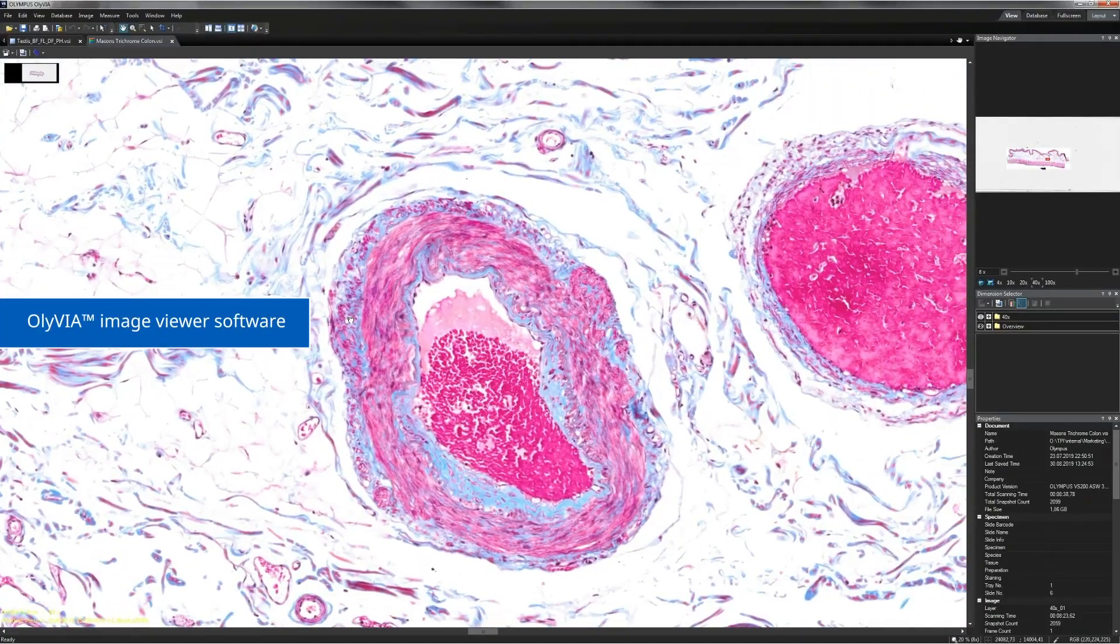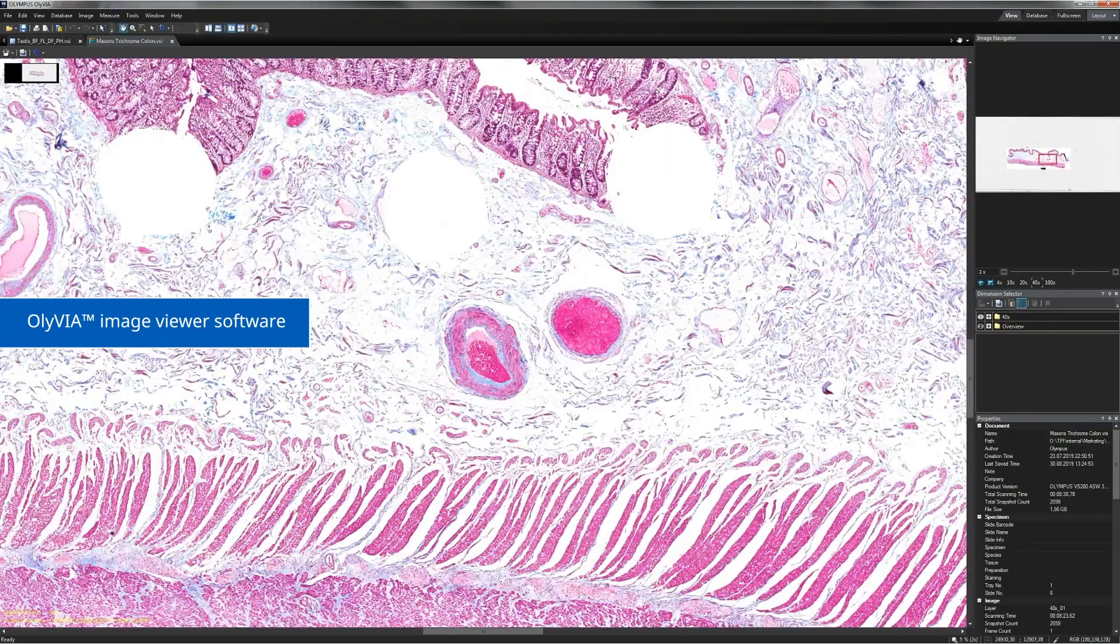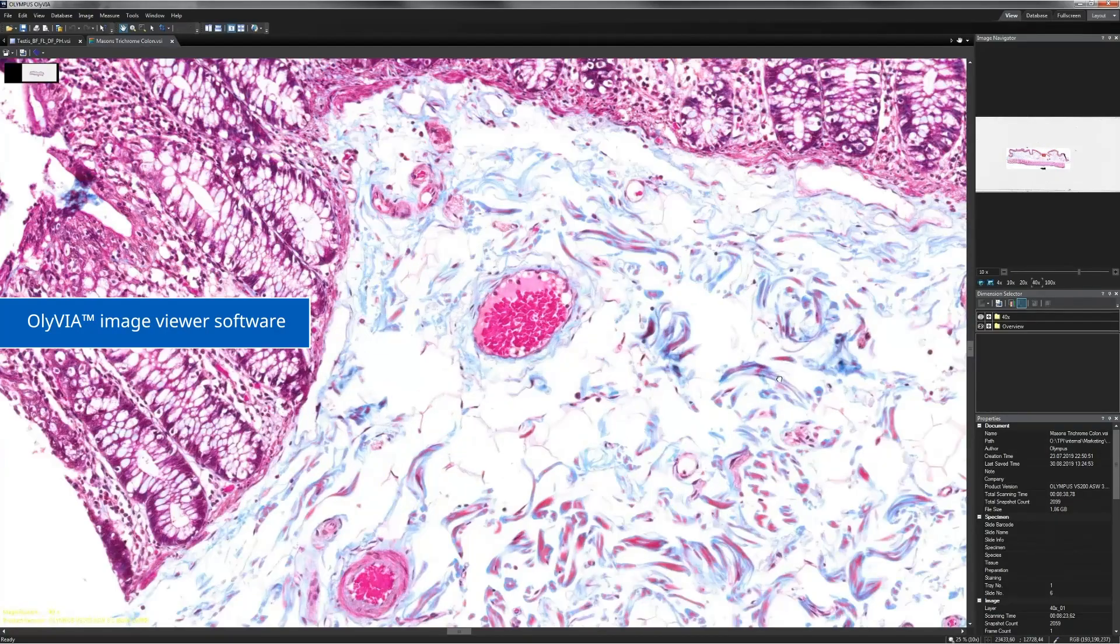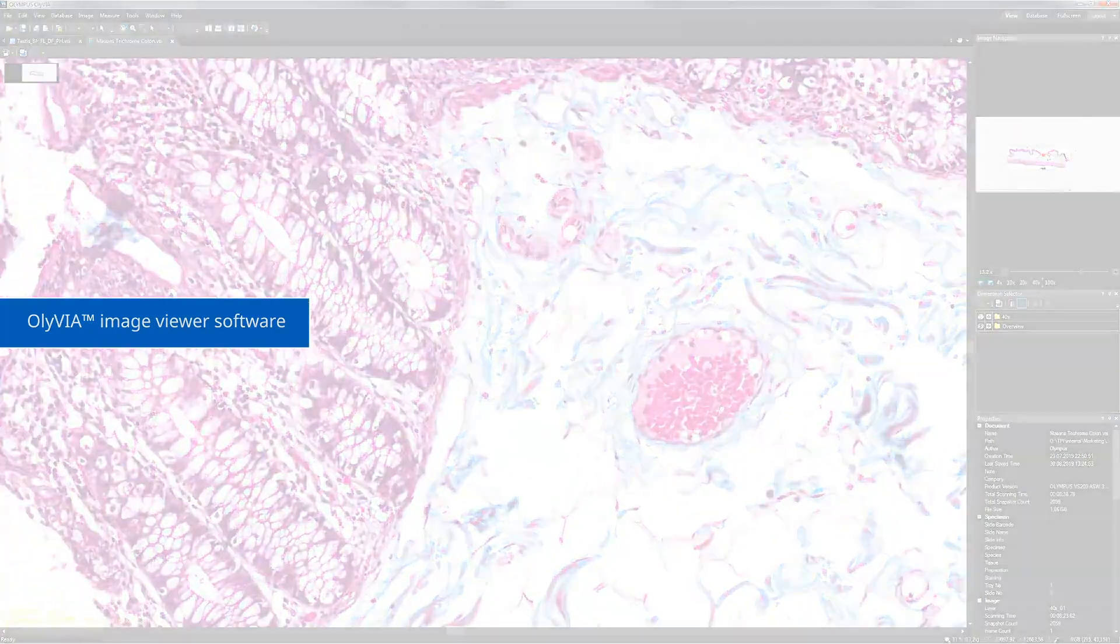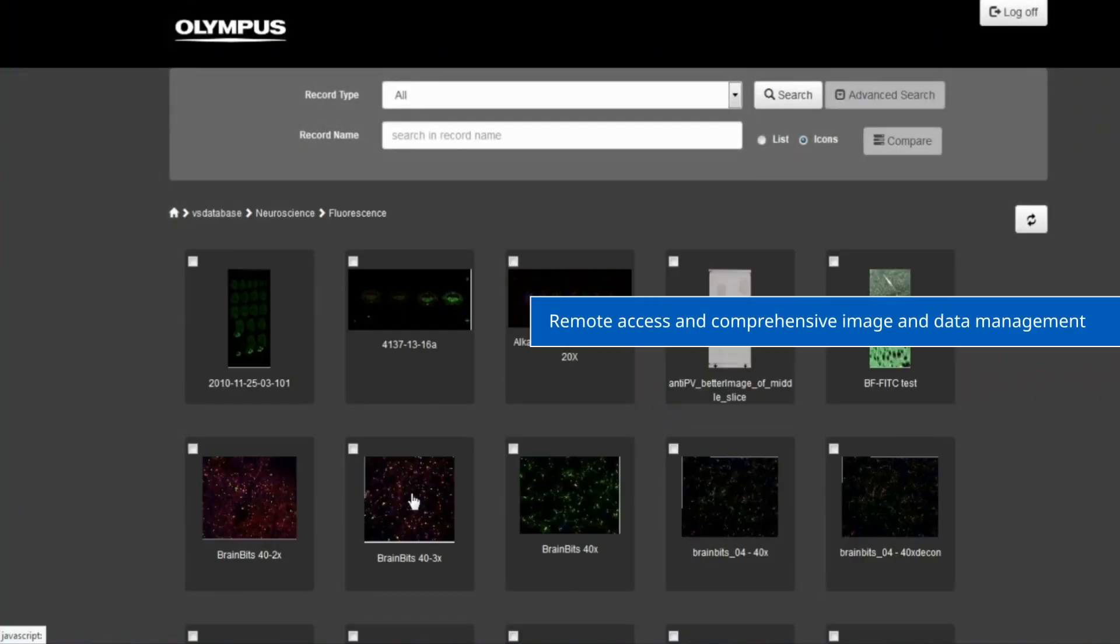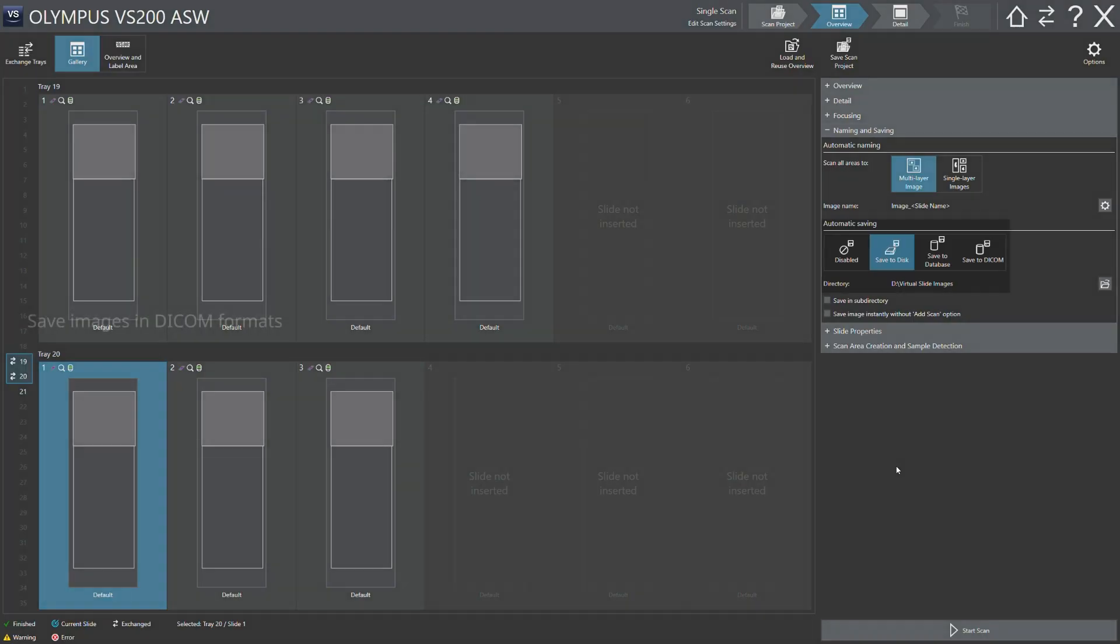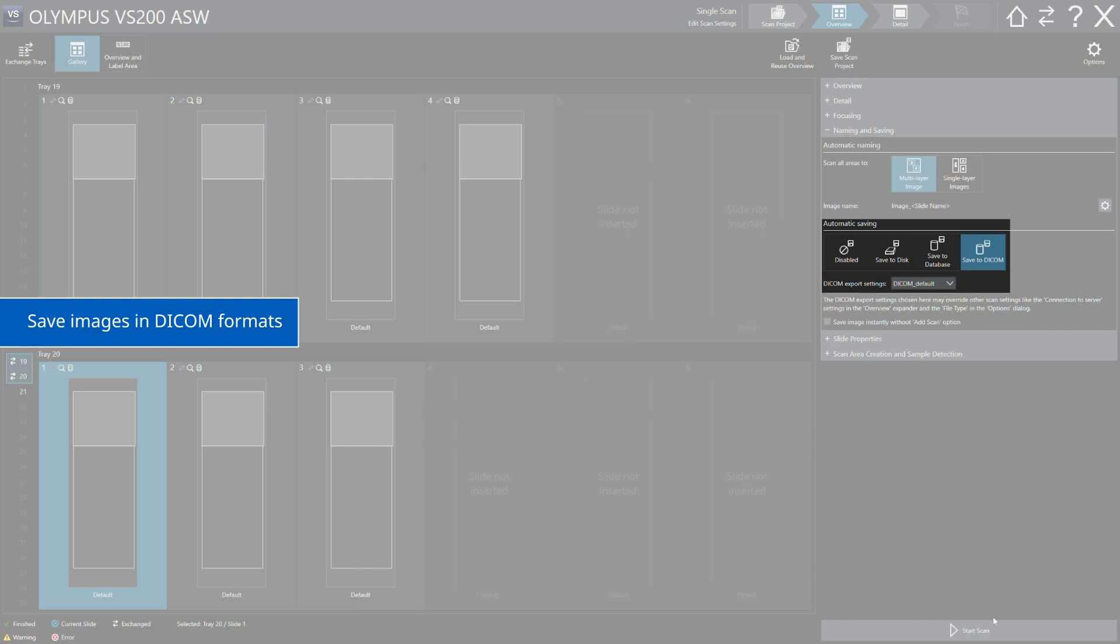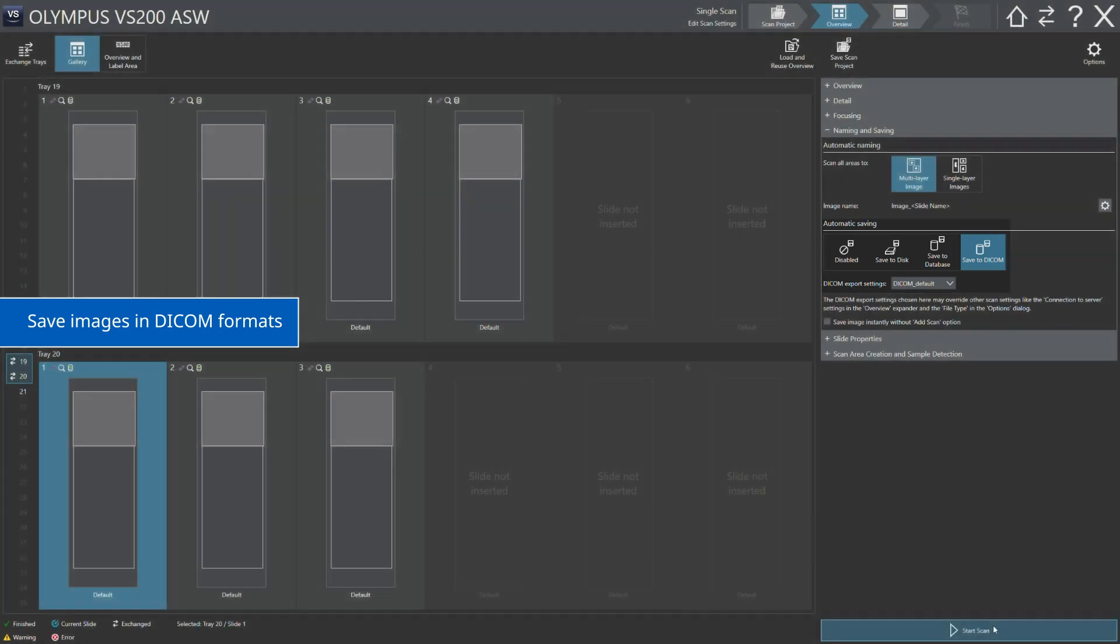Our OLIVIA Viewer software can access virtual slide images on local or network storage and images that have been saved on the NetImage Server NIS SQL database. It is also possible to save images in DICOM format directly to third-party image management systems.